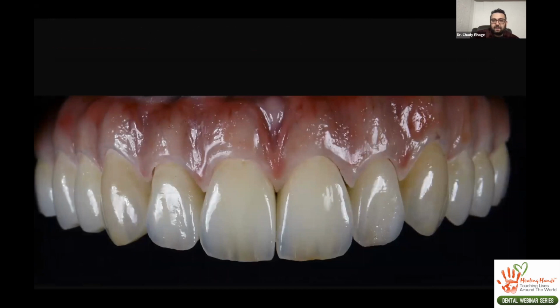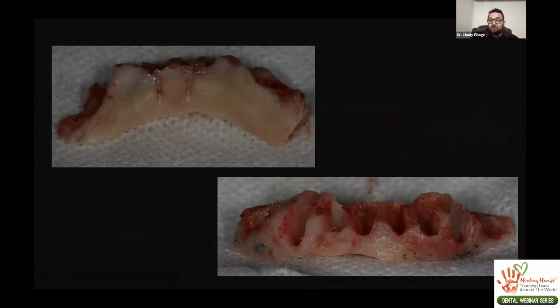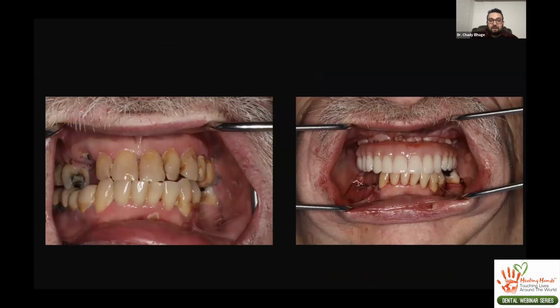This kind of shows you, when we start looking at where things are going to fit, that's typically how you can see how much bone is removed from surgery. We just chop the whole ridge off, typically about 6-7 millimeters, sometimes up to about 10 millimeters. And this shows you the difference. In this example, I didn't really change the incisal edge that much. If anything, I may have lengthened it about a millimeter just to create some overjet and overbite for the patient. But if you're measuring upwards, you can see from where the natural teeth are to where the immediate prosthesis is in place, how much you have to go up.